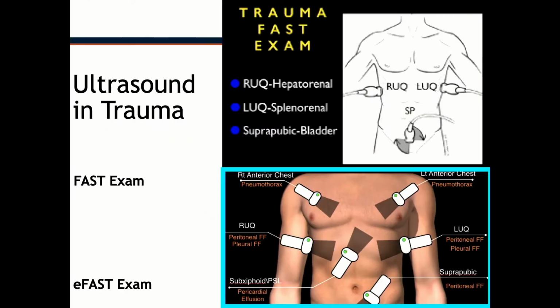Remember that ultrasound and trauma really is based around a point of care ultrasound, and the foundation scans for that are a FAST scan or an eFAST. The difference is the expansion of the FAST exam to include the thorax, and that really was the push for that. So instead of just having abdomen and pelvis images looking for free fluid, now we will examine the heart as well in one of our 3 image possibilities, and lungs to make sure there's lung sliding and pulmonary motion.